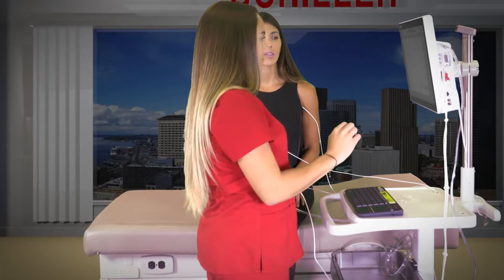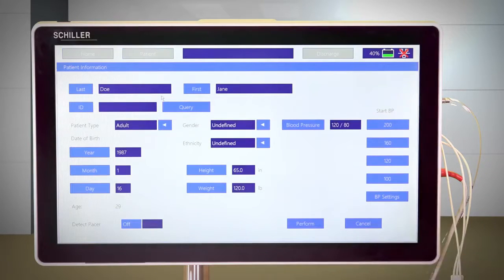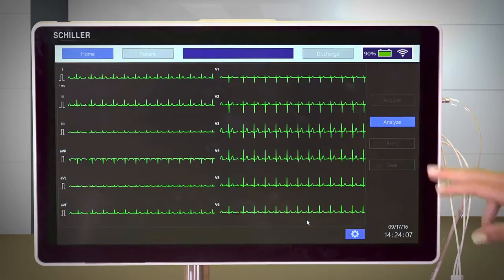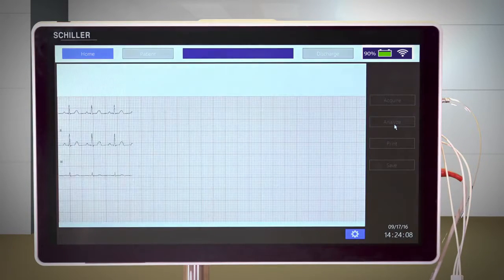Performing a resting ECG is quick and easy when the 10-wire ECG cable is connected. By inputting the patient's information and pressing Analyze, we can obtain a report with the patient information and interpretation.